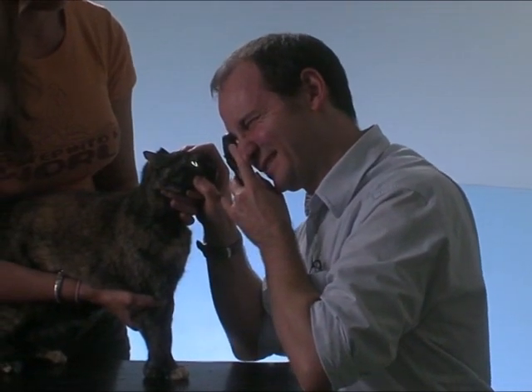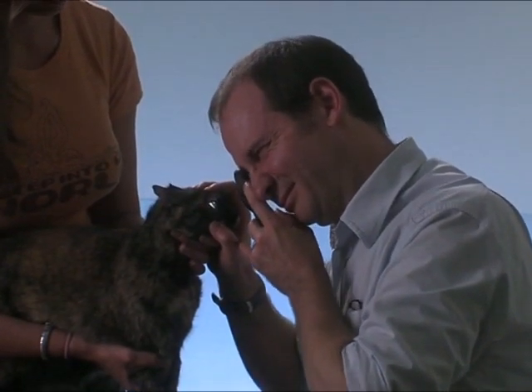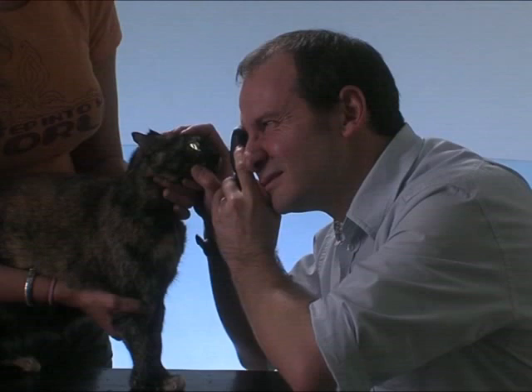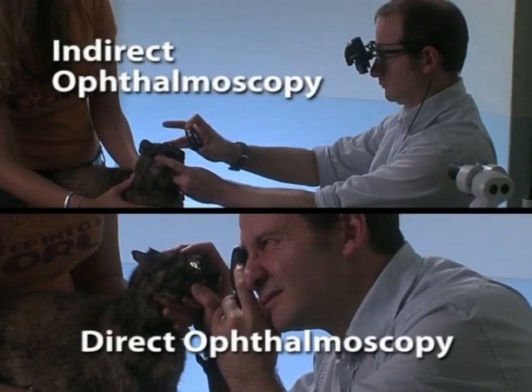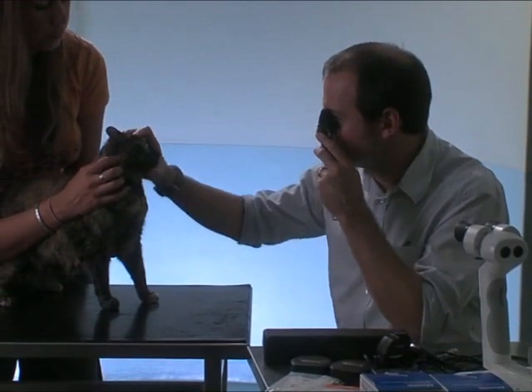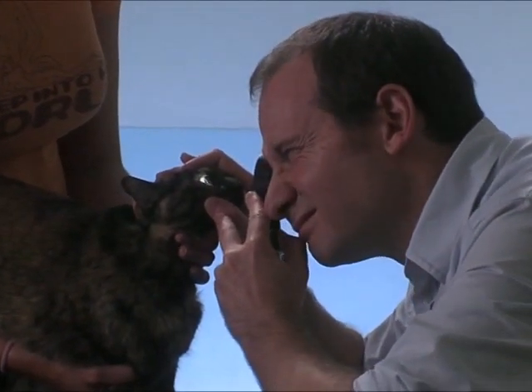Ophthalmoscopy is an important part of routine ophthalmic examination. Performing this procedure regularly builds confidence and makes it a more rewarding experience. The forms of ophthalmoscopy used most commonly in veterinary practice are direct ophthalmoscopy and indirect ophthalmoscopy. The direct ophthalmoscope has two main uses. In distant direct ophthalmoscopy, it is used to view the tapetal reflection to identify ocular opacities such as cataracts. From a close viewing position, it allows direct, detailed examination of the fundus.